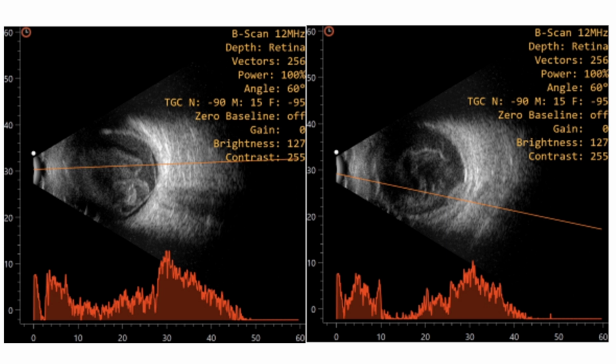Ultrasound image: no definite lens echoes noted. The vitreous cavity shows multiple dot and membranous echoes. A membrane echo with attachment to the optic nerve head is noted. On the right-hand side, there's a slight retinochoroidal elevation through which the vector is passing. So with the background history, what could that be? Probably a subretinal abscess. Good.